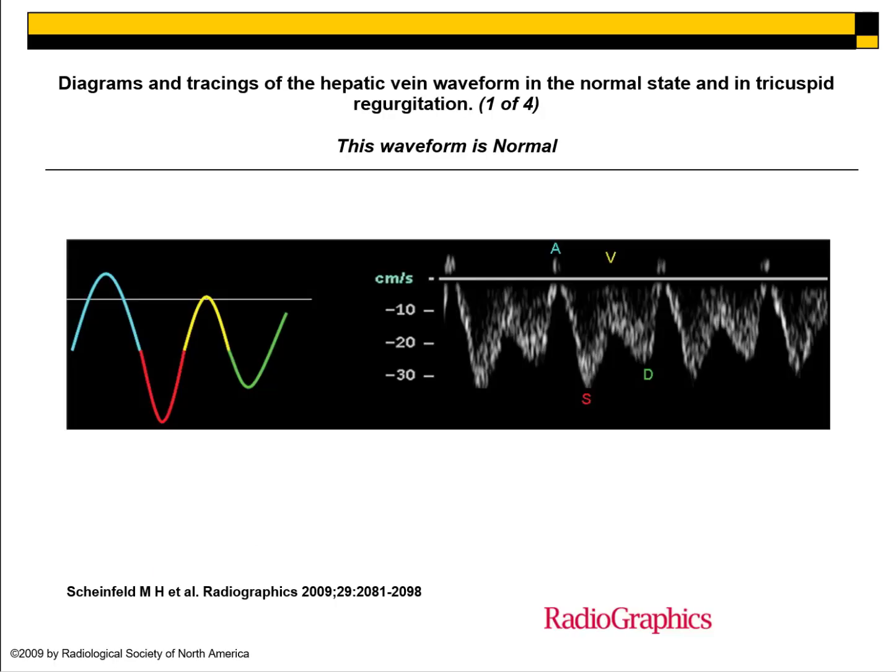Please check out the note sections on these upcoming slides. I copied and pasted them in there for you on purpose for reference. This is actually pulled from that supplemental hepatic venous waveform article that is on ICON. I highly suggest giving it a gander or at least reading it through once, but I really like how they have this set up.